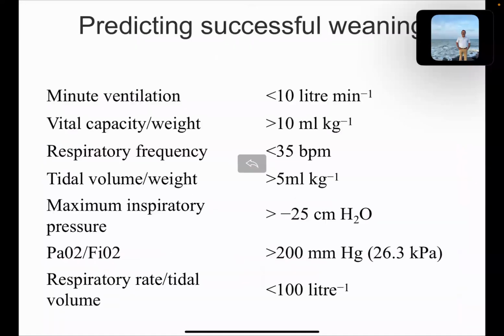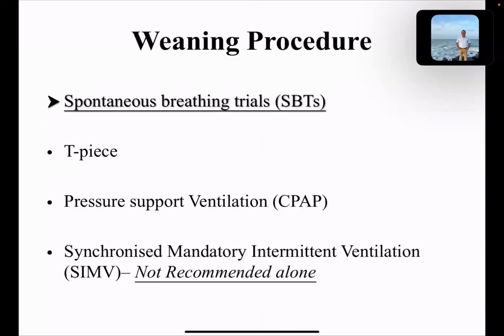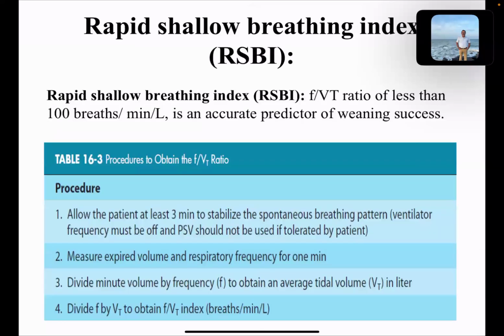So here I mentioned this. I'll just go back. The last point you can see is respiratory rate by tidal volume. So this is less than 100. This is the RSBI, or rapid shallow breathing index.